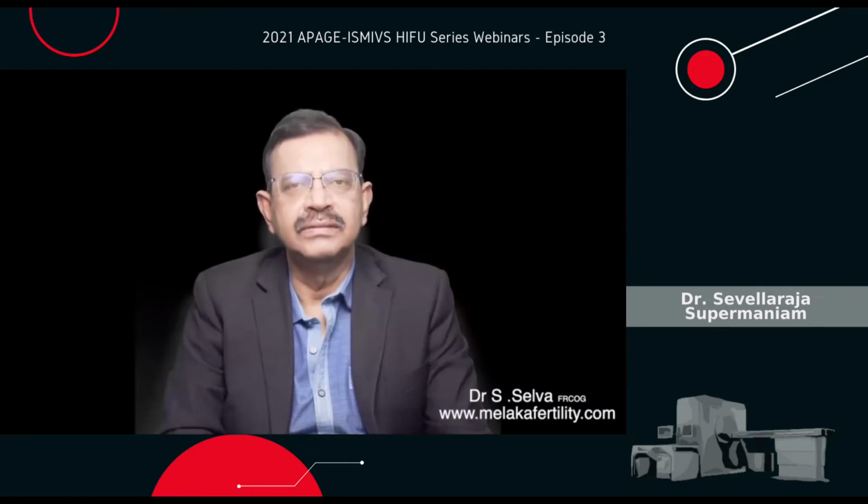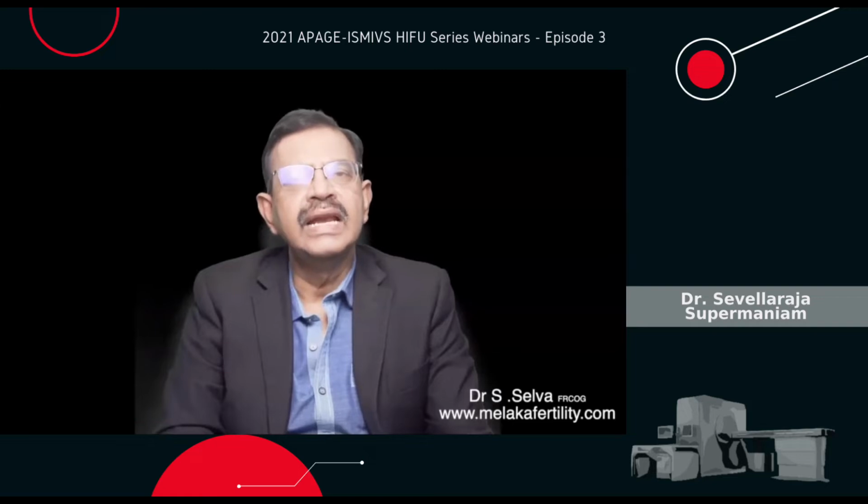This is very important. The patient is seen in my clinic the day before the surgery. She will be admitted. On the night before the surgery, she will be given 2 bottles of laxatives to drink to clean the bowel. She will be fasted from 10 p.m. On the day of the surgery, she will be given an enema. An intravenous drip will be set up and we will place a urinary catheter. She will be brought to the HIFU center and will be placed on the machine. Mild intravenous sedation will be given. Then we will perform the HIFU surgery.